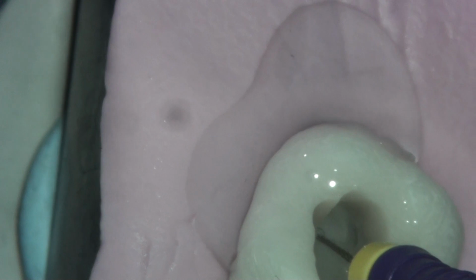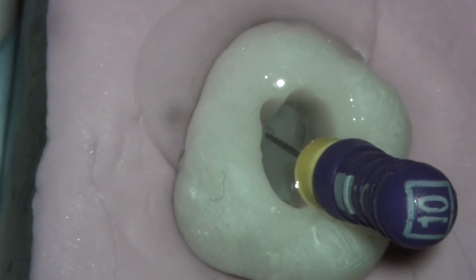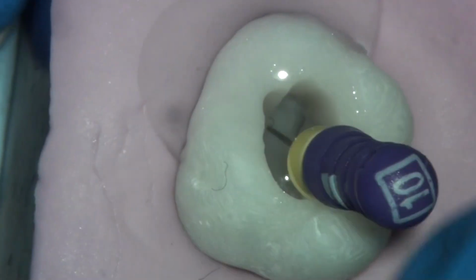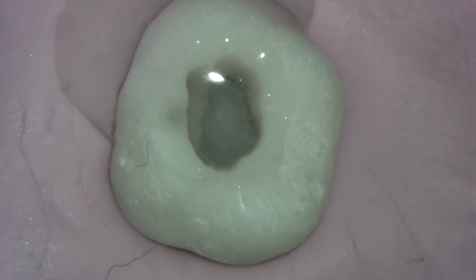Now I always scout these canals with a 21mm size 10, because in most cases that is shorter than the full working length of such a canal, and so we can safely introduce our size 10 21mm even down to its stopper and know that we're not out through the apex of the tooth. So we again take our file out, and of course at this point we irrigate copiously again.